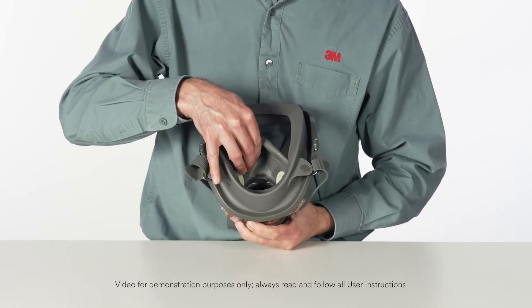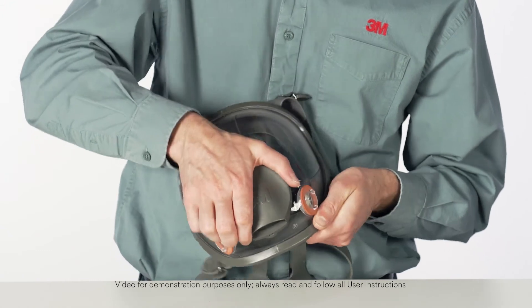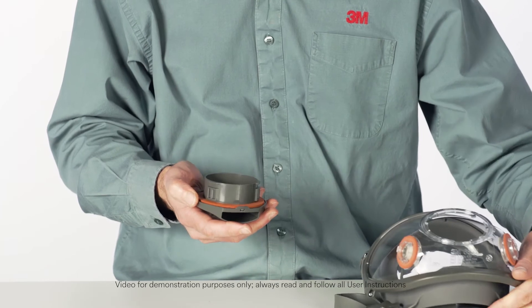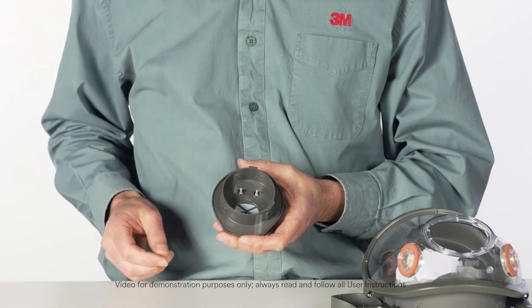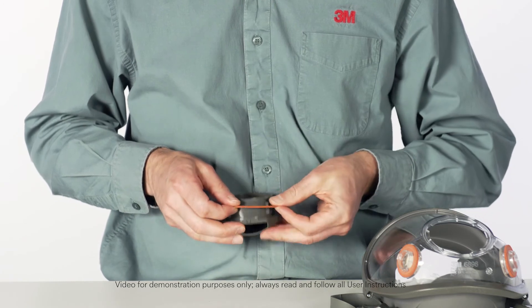Remove the nose cup assembly by pulling it away from the center adapter. Grasp the center adapter cover and twist it counter-clockwise one quarter turn to disengage it. Remove the center adapter from the lens. Remove the center adapter gasket.